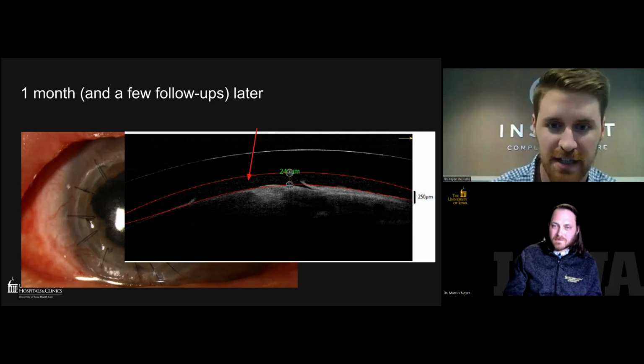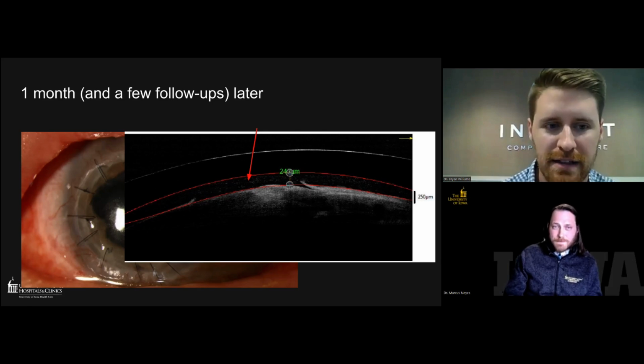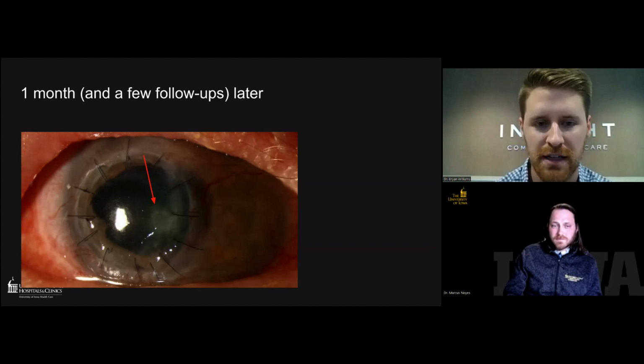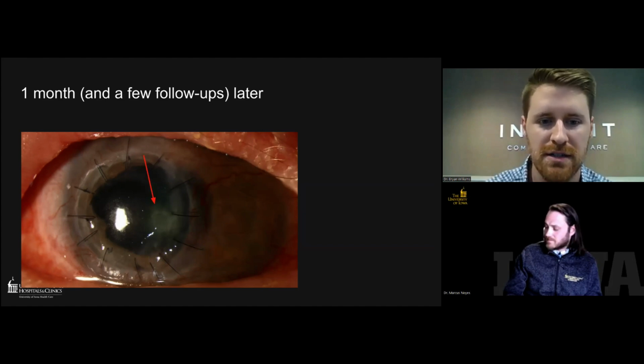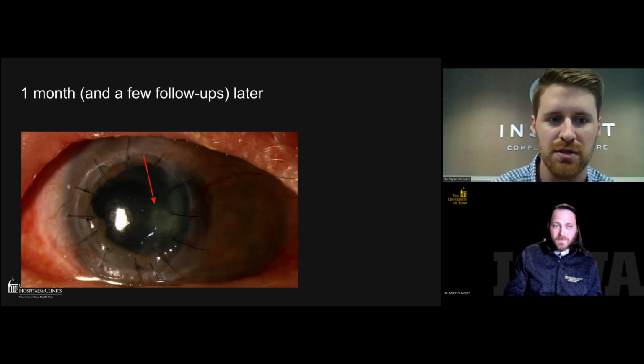A lot of times they're healing what's going on underneath it. I mean, night and day difference looking at this eye compared to the day you saw it. So clearly the lens is going to fit differently, so setting those patient expectations that it's going to change. And this is a long work in progress for sure.